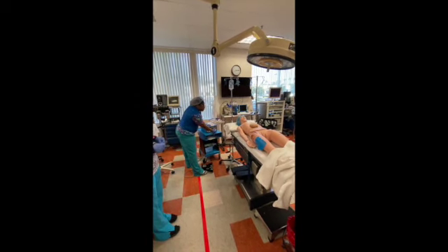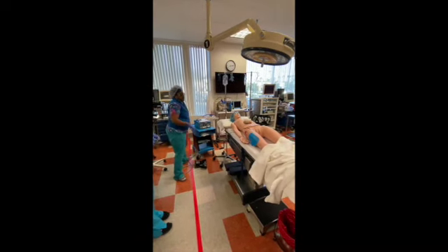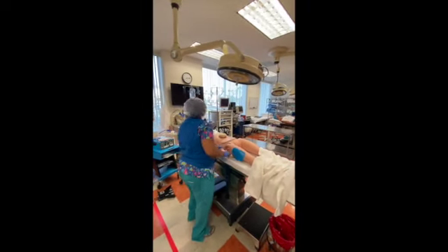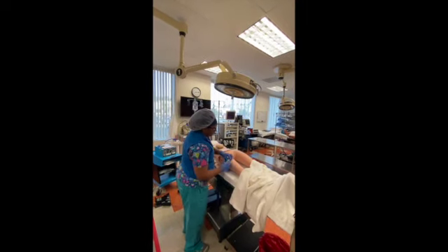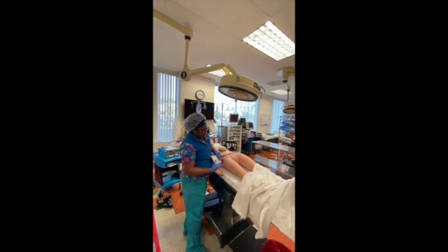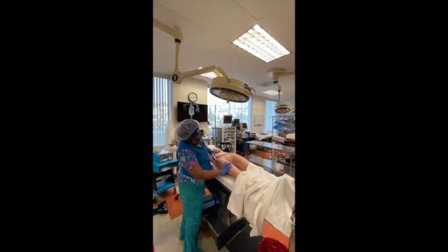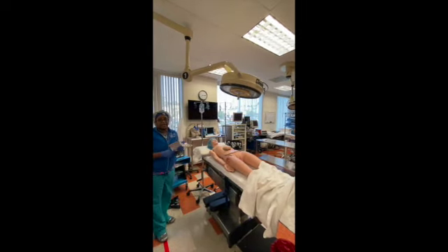It would go right here. At the end of the case when the drapes are down, you're going to pull this off. You're checking the skin — the integrity is intact, there's no bruising, no redness. Everything's good. That's the end of that lab.